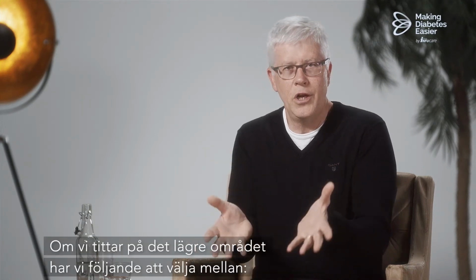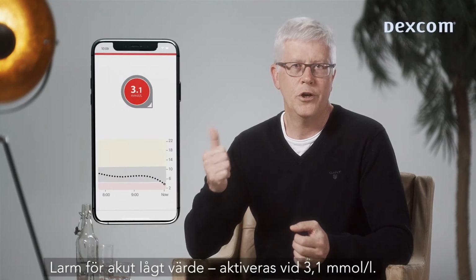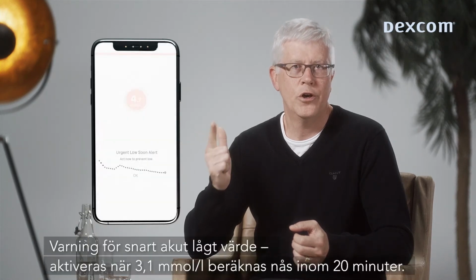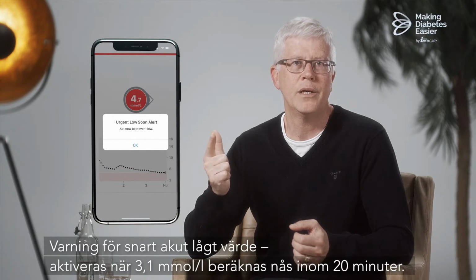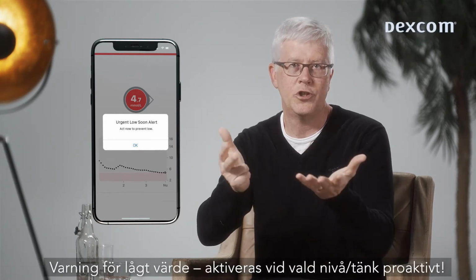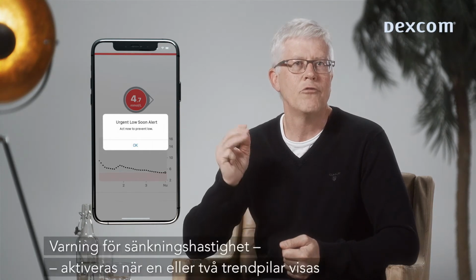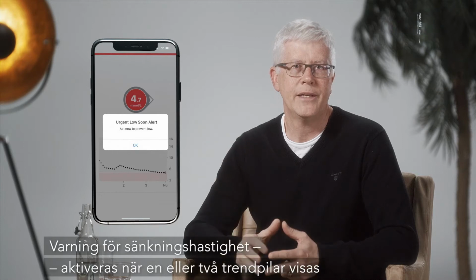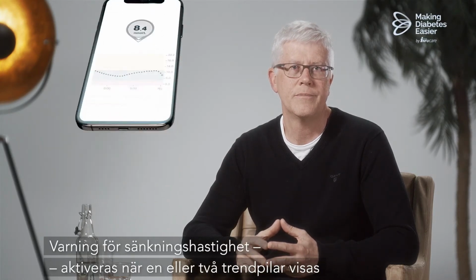If we then look at the lower range, we have the following to choose from. Urgent low alarm, activated at 3.1. Urgent low soon alert, activated if 3.1 is reached within the next 20 minutes. Low alert, activated at a chosen level, and then think proactive. And rate of fall alert, activated when 1 or 2 trend arrows are present.